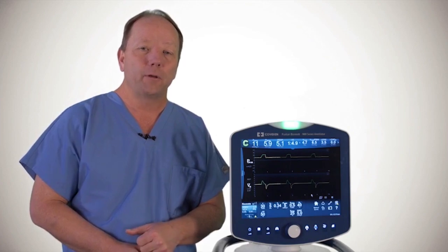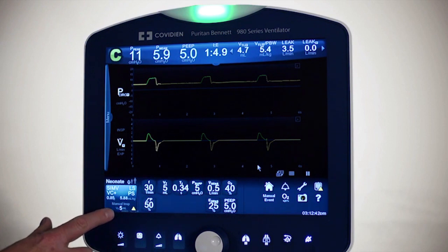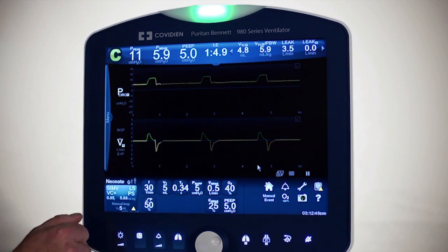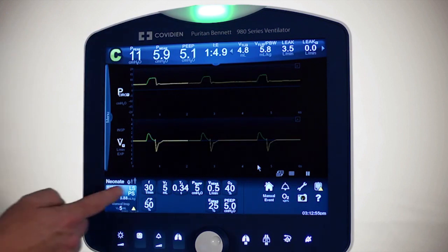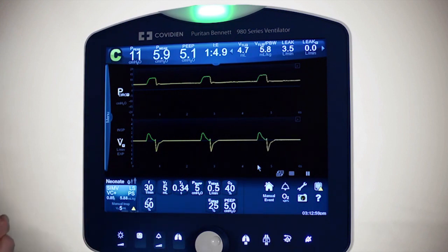Let's take a look at the ProxFlow sensor. Right now I am in a VC plus mode of ventilation, with LeakSync software on, in SIMV VC plus. The ProxFlow sensor will work in any invasive mode of ventilation — I've just picked these for an example. I have a rate of 30 and a tidal volume set delivered of 5 milliliters.